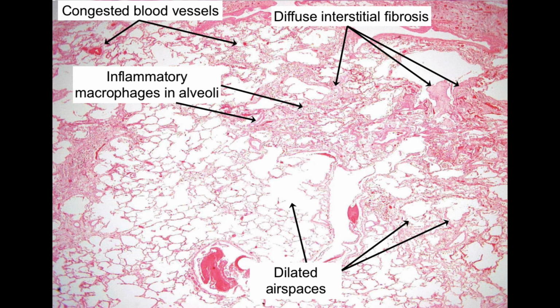Within the alveoli, you will be able to see some brown and elongated asbestos bodies. These are inhaled asbestos fibers that have been coated with hemosiderin and macrophage-derived protein, and they arise when macrophages attempt to phagocytose asbestos fibers. The hemosiderin is derived from digestion of red blood cell hemoglobin by the macrophages in the alveoli. Red blood cells extravasate into the alveoli from blood vessels made leaky by the ongoing inflammation and pulmonary hypertension.